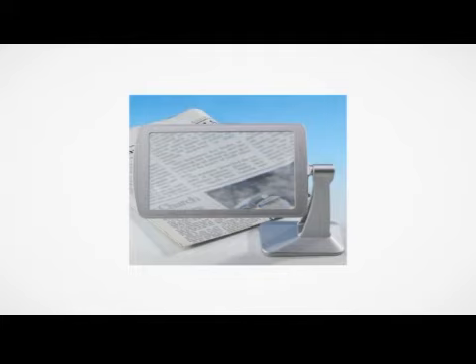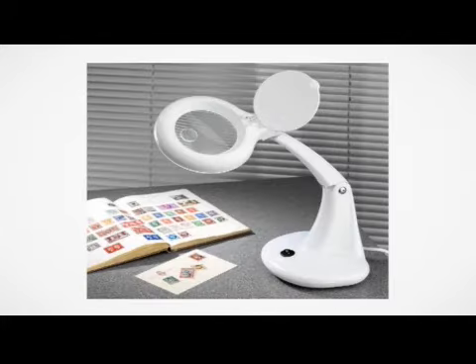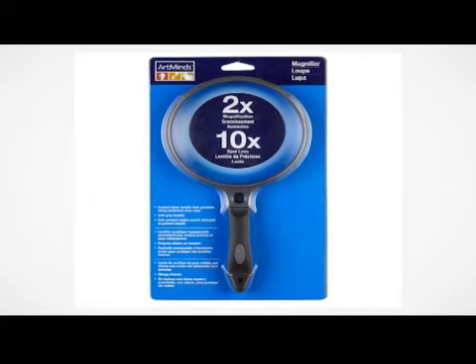Stand magnifier. A fixed focus stand is a convex lens in a rigid mount that has been set by the manufacturer to focus closer to the page than its focal distance to reduce peripheral aberration. Most stand magnifiers are designed for use with a standard bifocal add or reading glasses. Powers are available up to 24 diopters.